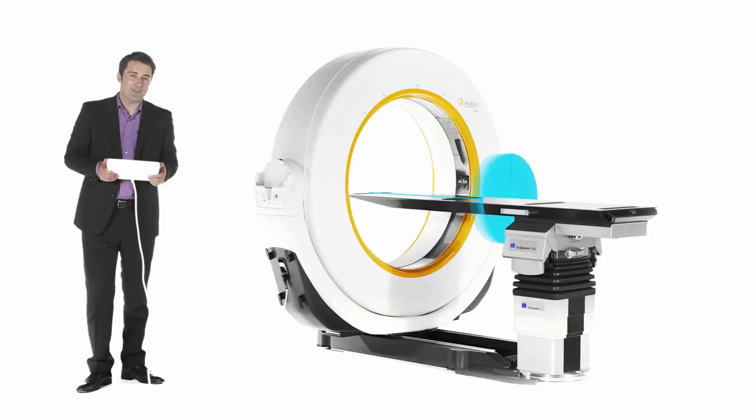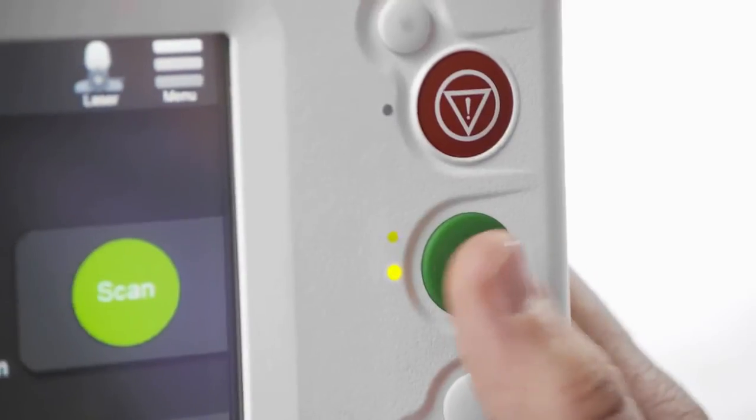This range allows surgeons to image the entire spine in a single scan in about 30 seconds. The green button begins the scan.